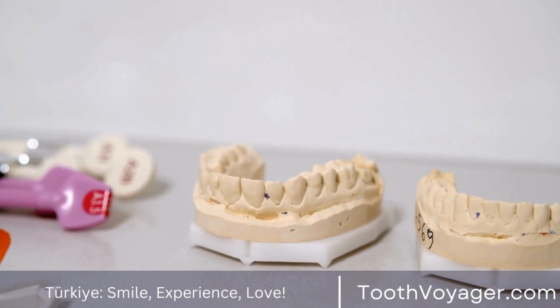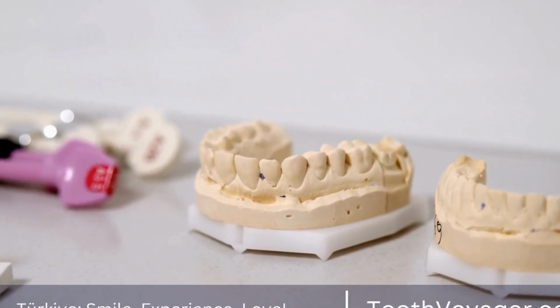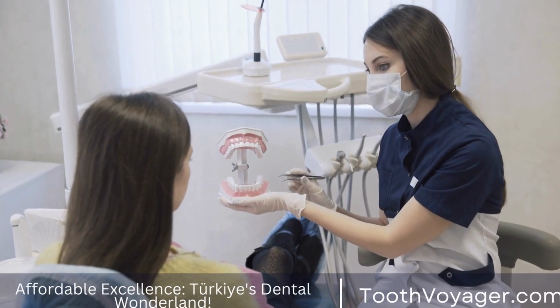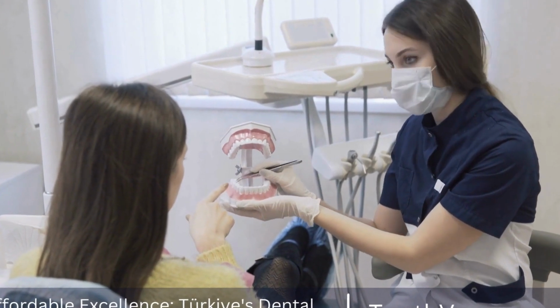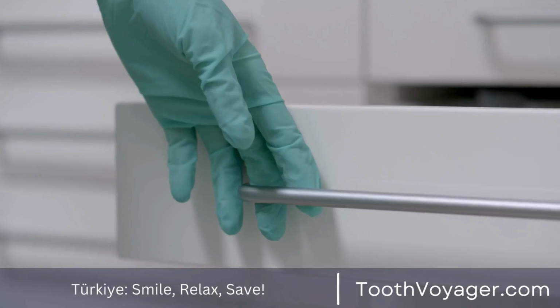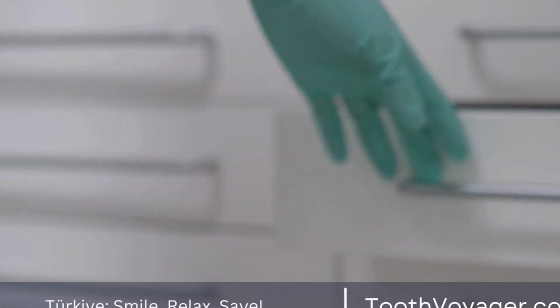When the dentures have been made and fitted, the next stage is to set up a fitting appointment. At this time, the dentist will check that the prosthetics sit comfortably inside the mouth of the patient and that they are comfortable to wear. Additionally, the patient will receive directions about how to maintain the prosthetics and keep excellent dental hygiene.